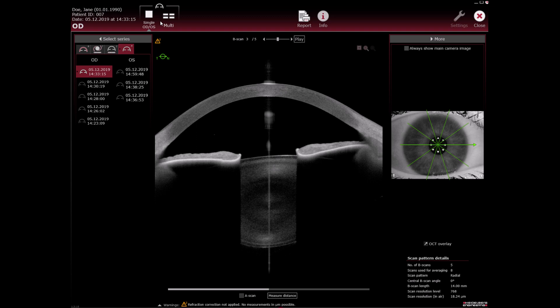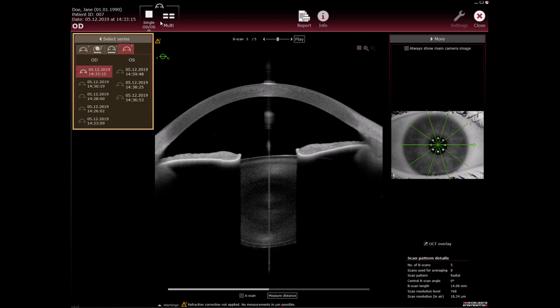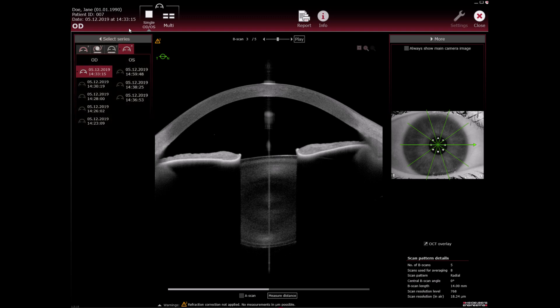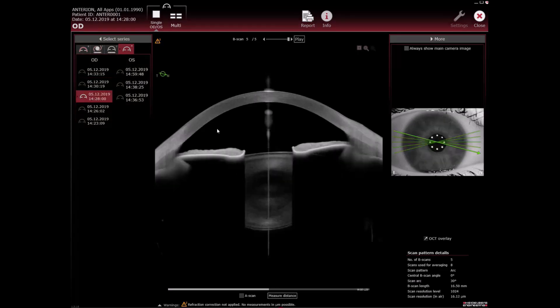Select the desired series in the select series section. To display the IR overview image with the average pupil diameter for the OCT images, select the always show main camera image checkbox.